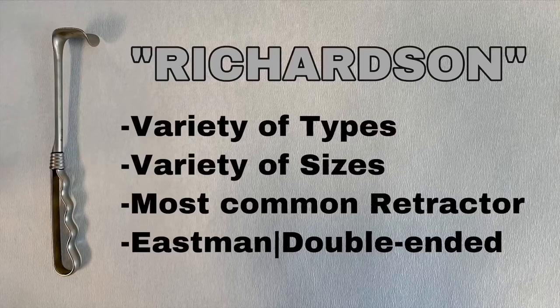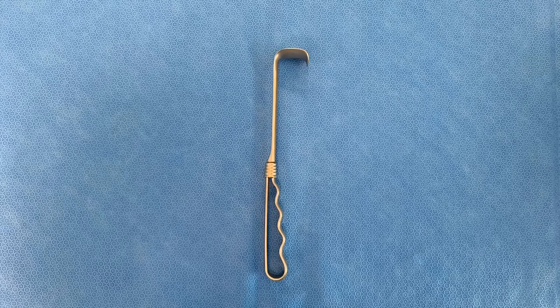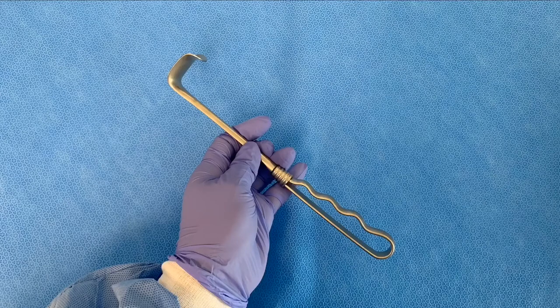This is the Richardson retractor. It comes in different sizes and different types of handles. This is the most common retractor in the set, and the double-ended one is called the Eastman retractor.